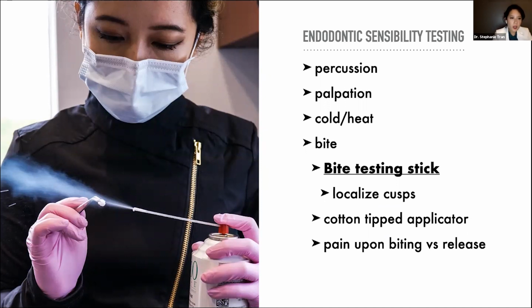And then for cold and hot testing, the heat testing is usually done with warmed gutta percha or something like that.